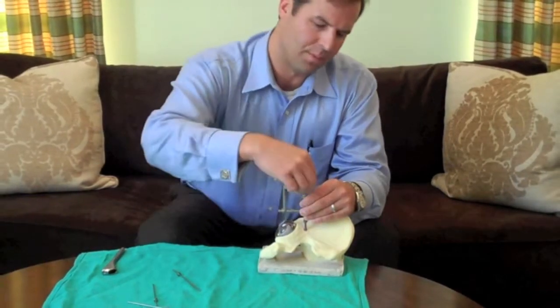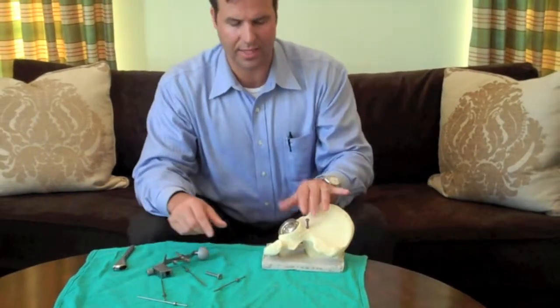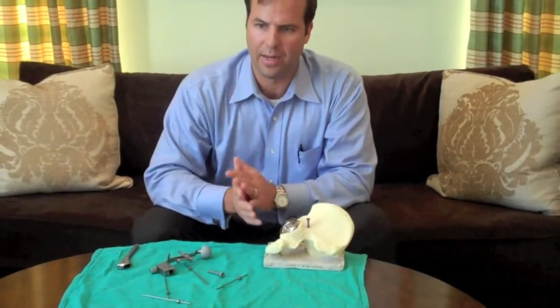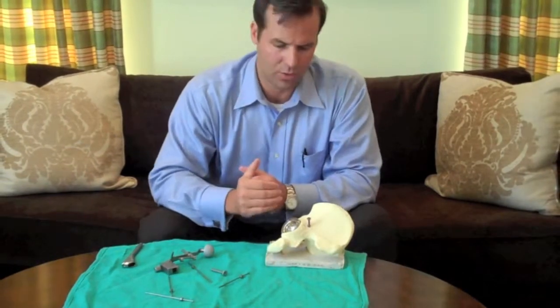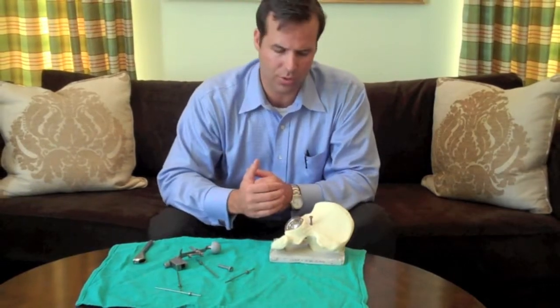So once their measurements are done, just take out the acetabular guide, take out the stylus, take out the cannulated screw, and exchange the femoral broach for whichever modular or non-modular neck femoral component you wanted to use.